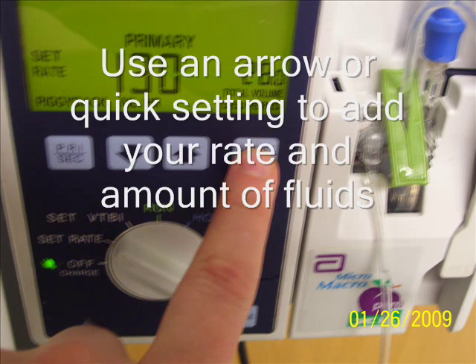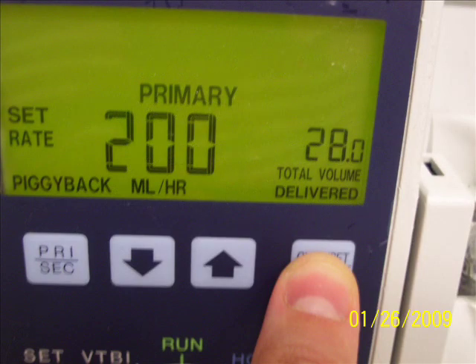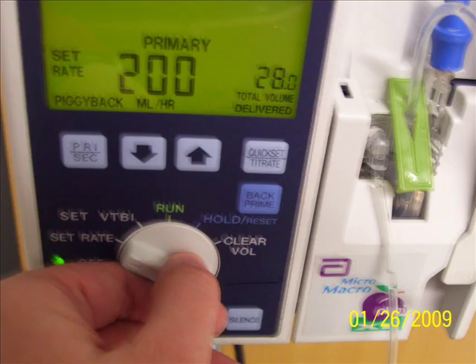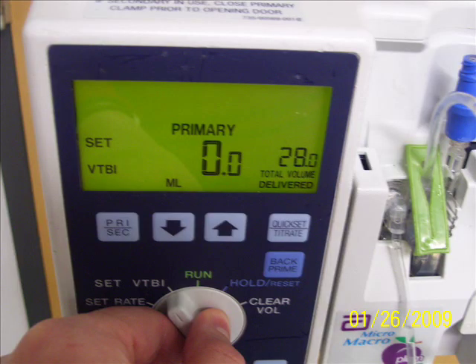This is the rate. We can use the arrow or a quick-set button if we want to change it fast. With the arrow it goes a little bit slower, depending on what kind of personality you are and if you have enough time to stay there. If you continuously keep your finger on these arrows, the numbers will go smoothly. If you take your finger off, it will go number by number — from 2 to 3 to 4. Volume to be infused means VTBI, so we are putting our setting to the volume to be infused.